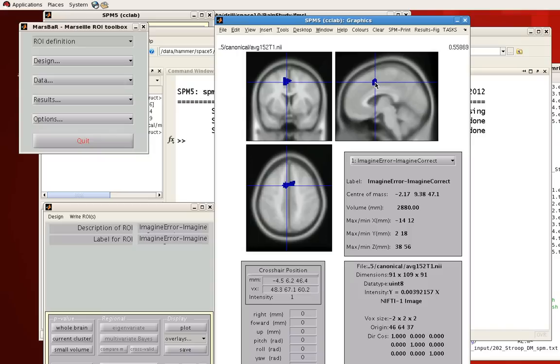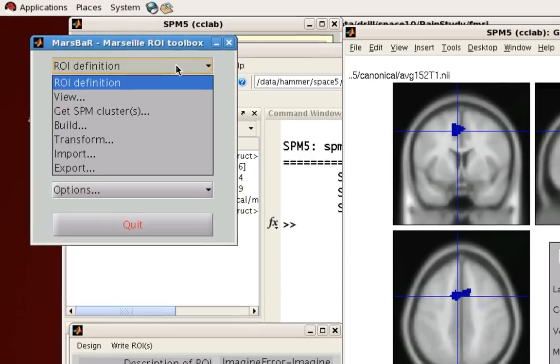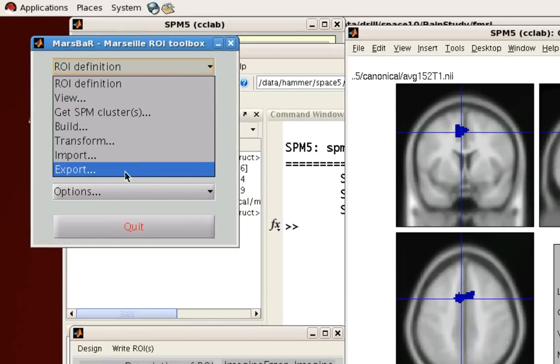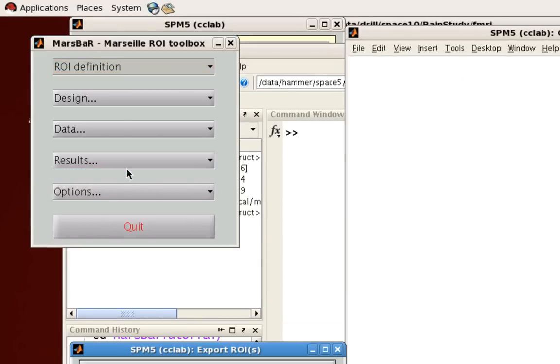So just view it, make sure that it looks like how you think it should look. And then you can go ahead and export this into NIFTY format.